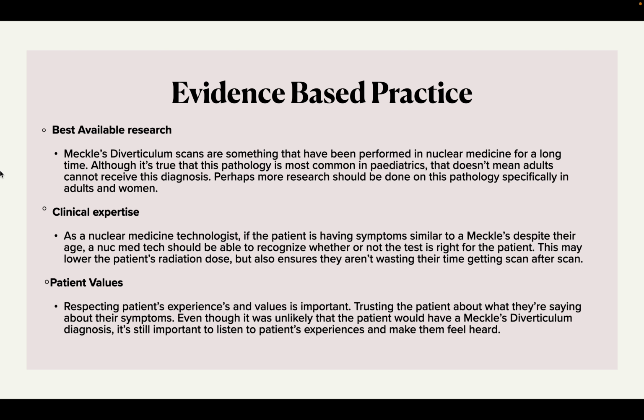So Meckel's diverticulum scans are something that have been performed in nuclear medicine for a long time. Although it's true that this pathology is most common in pediatrics, that doesn't mean adults cannot receive this diagnosis. So that being said, more research should probably be done on this pathology, specifically in adults and women, just because there is that little bit of bias in nuclear medicine, but also, obviously this case was positive. So it's not just all pediatrics and all males who get this pathology. So I think there should be more research in this.